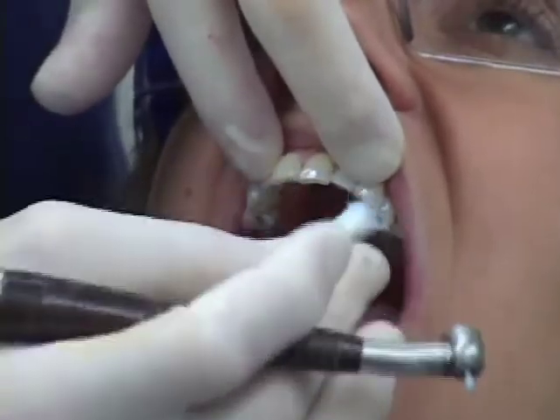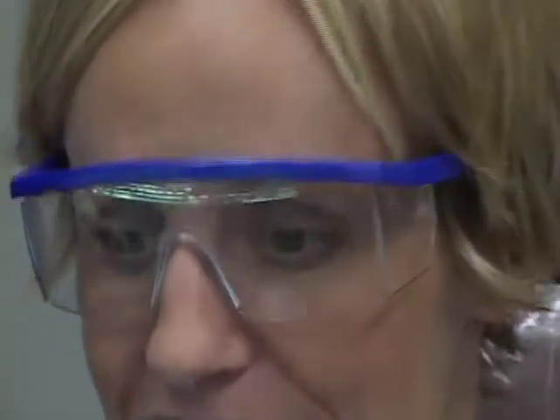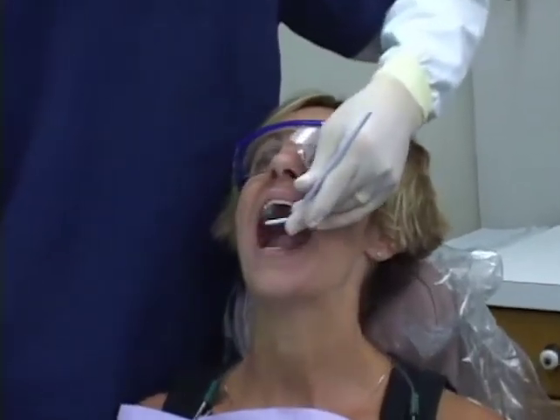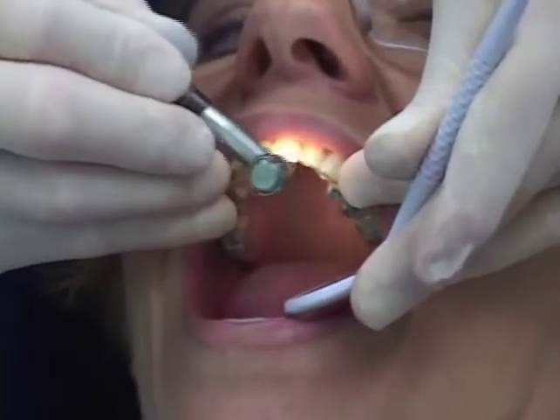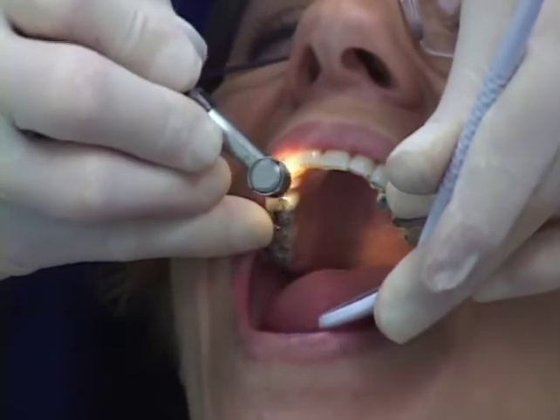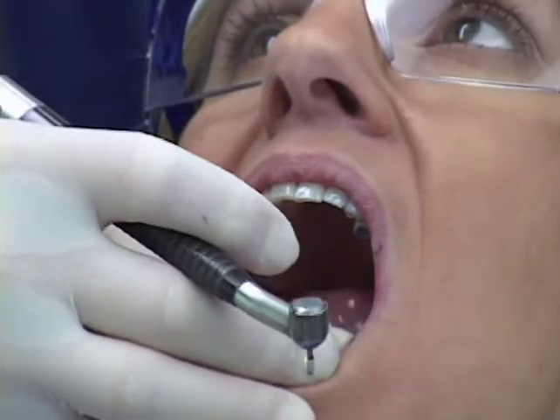This is very minimal. I have the choice of either reducing the lingual of the upper anteriors, or I can very lightly reduce the facial incisals of the lower anteriors. The amount of reduction we're dealing with is very minimal - I'm not really shortening these teeth. Remember, we're dealing with paper that's 200 microns thick. Let's go ahead and try the blue again. I still have a little bit of a mark here on tooth 8, and on 9 and 10. At this point, let's go with some red silk - I believe it's 60 microns.